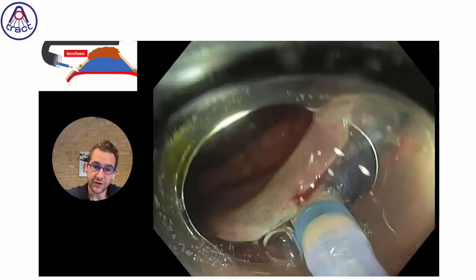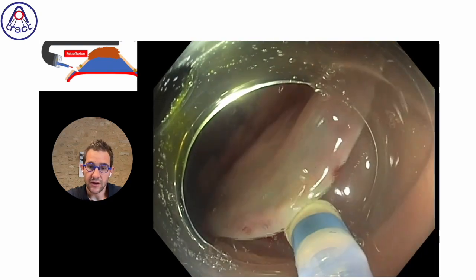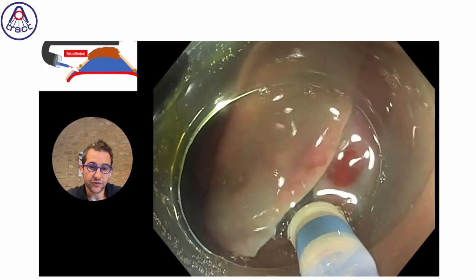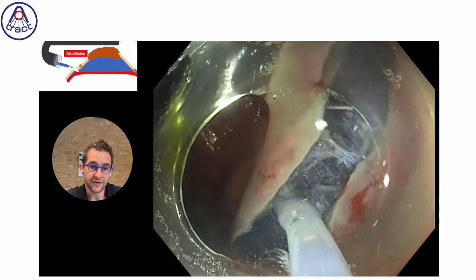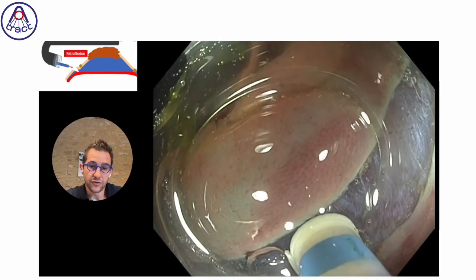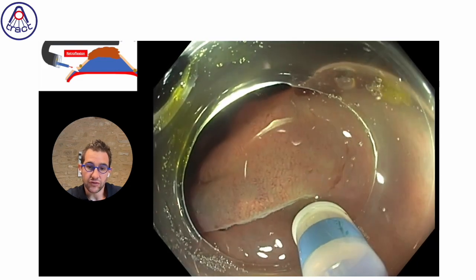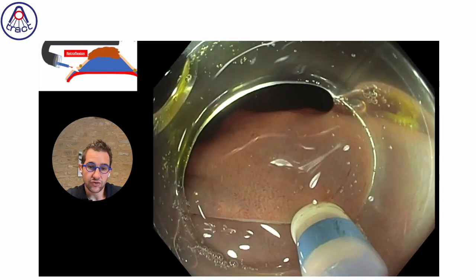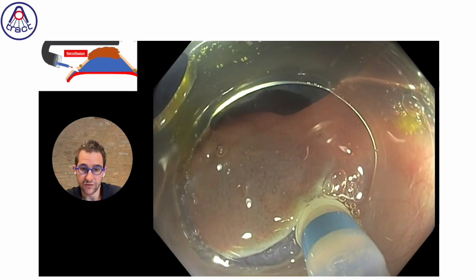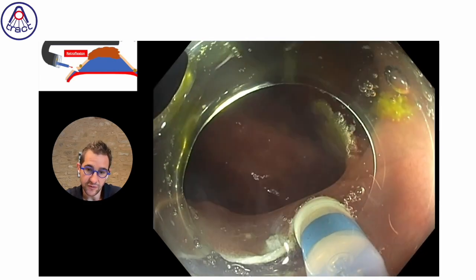And immediately after, I will do my trimming and my first dissection in retroflexion in order to facilitate the end of the procedure once the traction is on side, because it is sometimes difficult if the field is not open enough to achieve the resection. So once again, I try to combine enlarging the incision to the top of the fold by re-injecting and doing it in retroflex position.